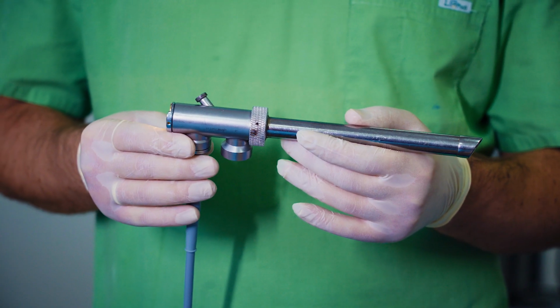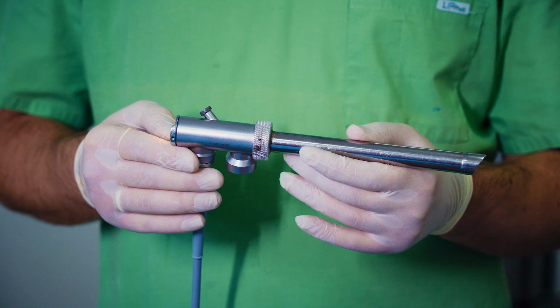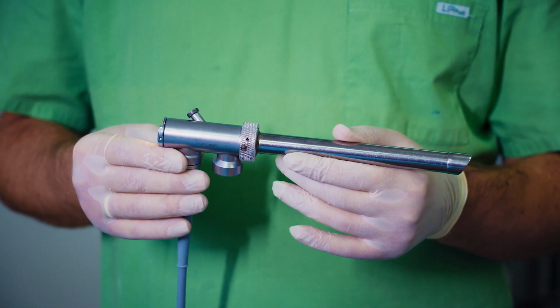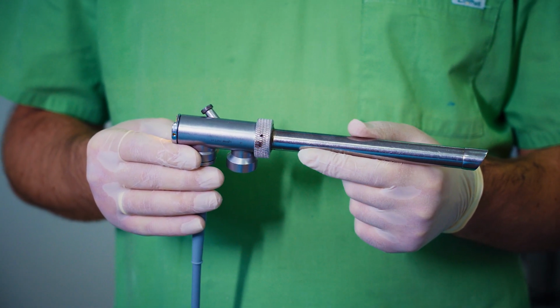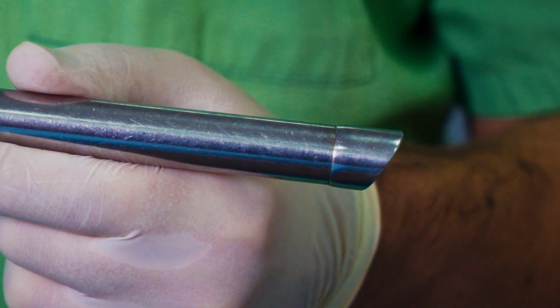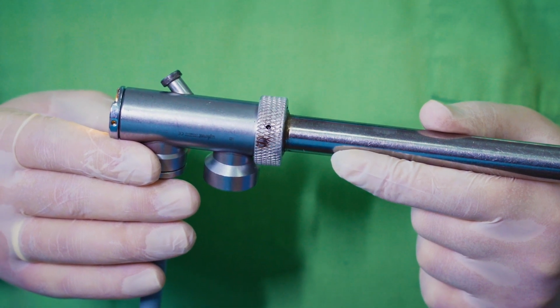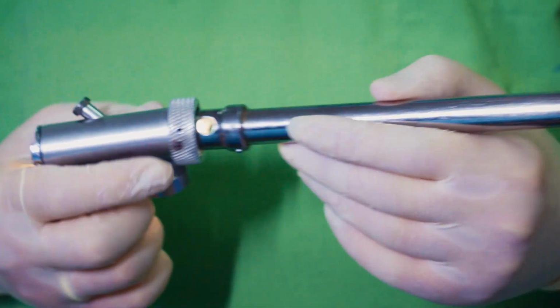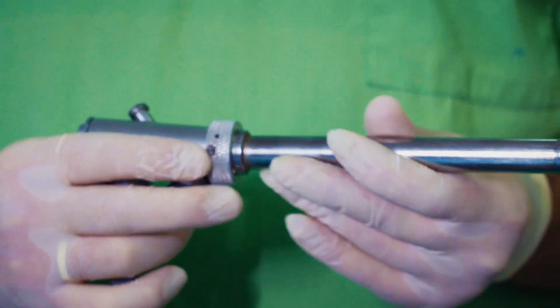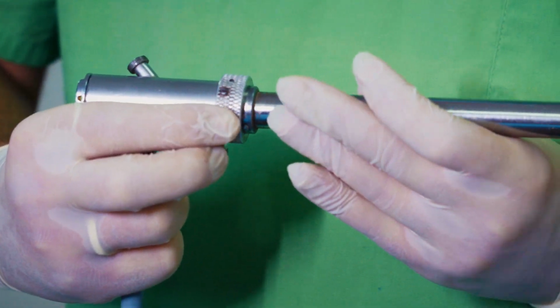The rigid tube for laryngoscopy is a 15 to 25 centimeters long, straight, hollow tube, round in shape, with a diameter of 5 to 20 millimeters and a bevel end distally. An intermediate piece that has a prismatic light deflector with a connection to a light source is attached to the proximal end of the rigid tube. When in use, the image is obtained directly looking through this assembly.